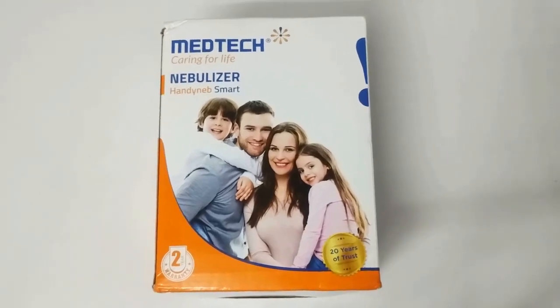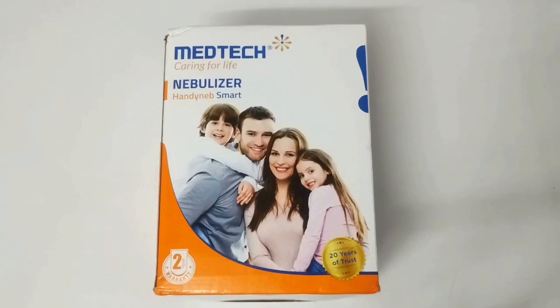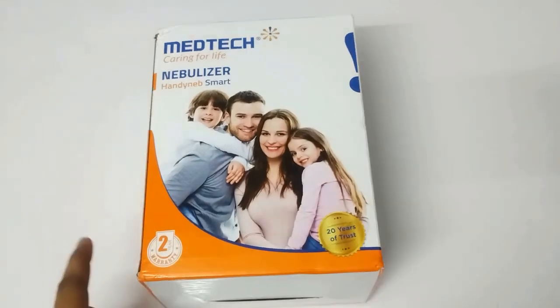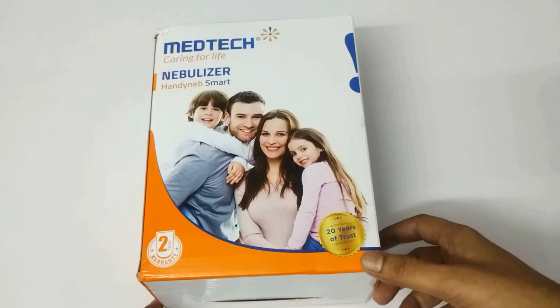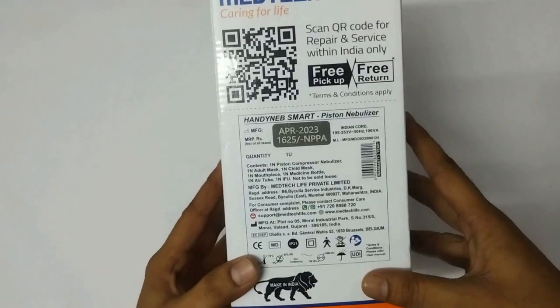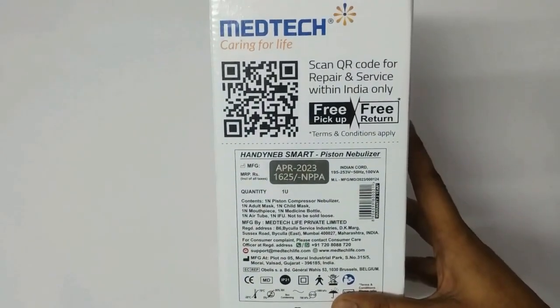Before we unbox, let me show you the features of this product. This is manufactured by Medtech Life Private Limited, the largest manufacturer of nebulizers in India. On the box you can see it mentions a two-year warranty and 20 years of trust.